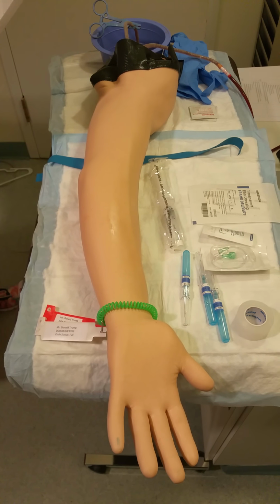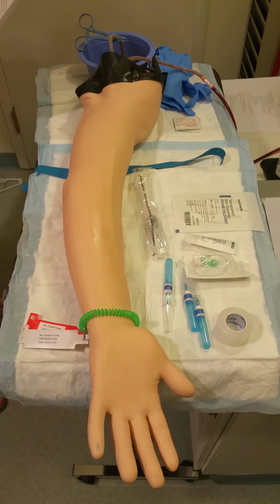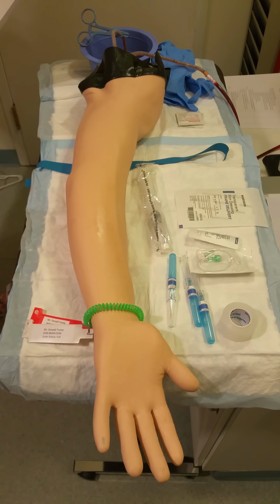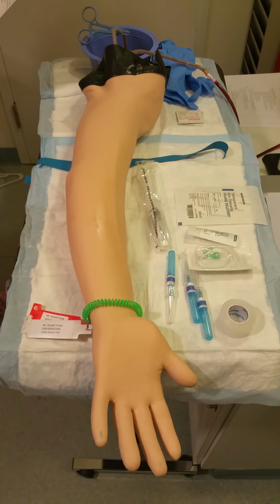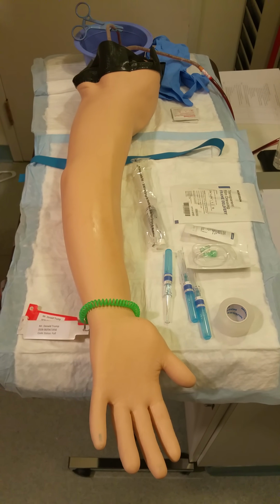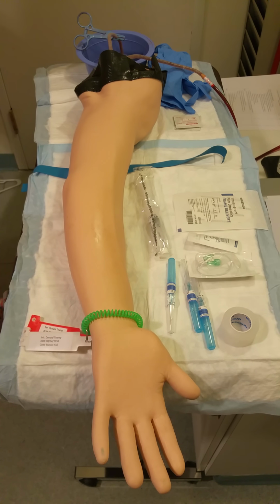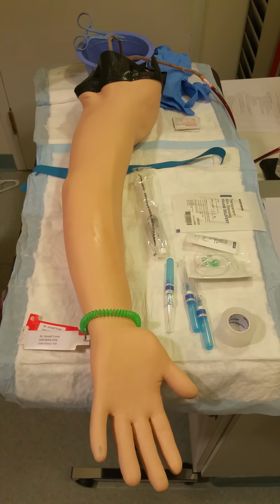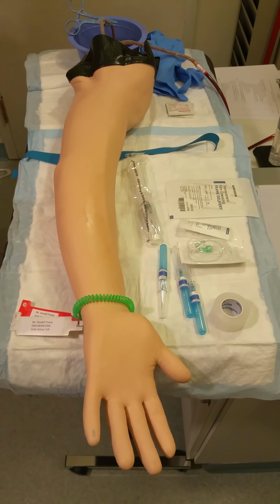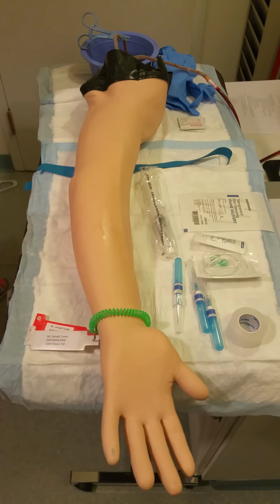I'm at the nurse's station and I see my celebrity patient Donald Trump. The doctor has written an order for him to have a peripheral IV, and then we'll infuse 0.9% saline solution at 125 ml per hour, and he's prescribed 2 liters. So my first step is to get that peripheral IV started for Mr. Trump. His doctor's orders read thusly.